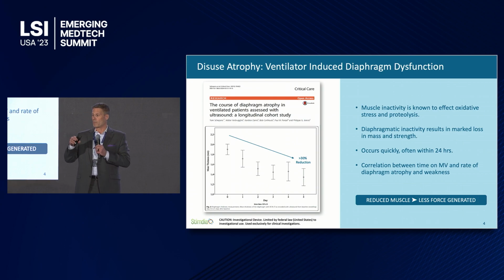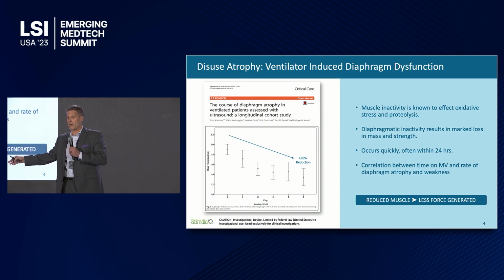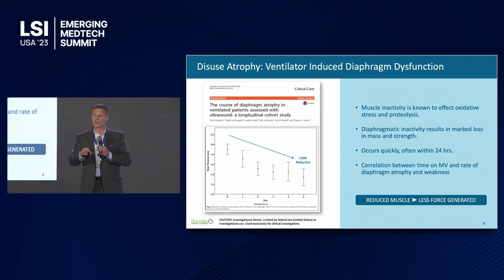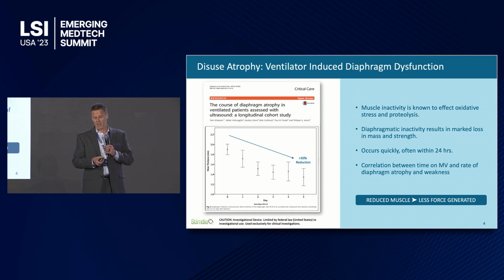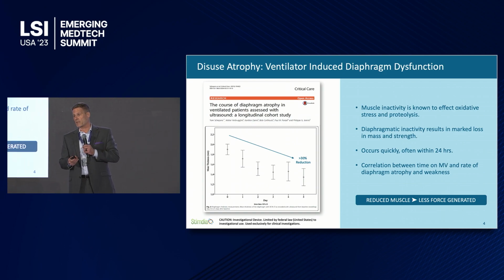Bulk on the diaphragm leads to decreased strength. Decreased strength means that these patients can't breathe independently. And there is no physical therapy that's really provided to these patients because they're knocked out. So we've got a method now to be able to do it in a non-volitional manner. If you take a look at that first tick on here, atrophy sets in within 24 hours, and you can already see a decrease in that muscle thickness on those patients.